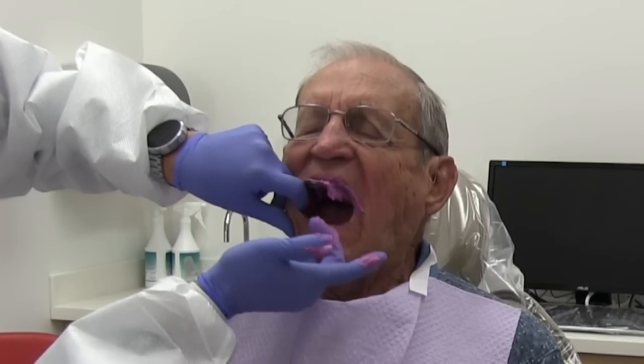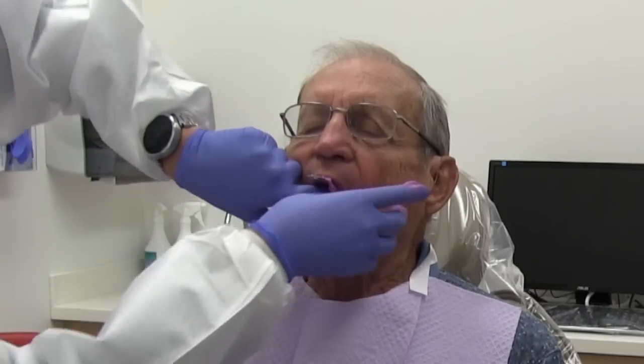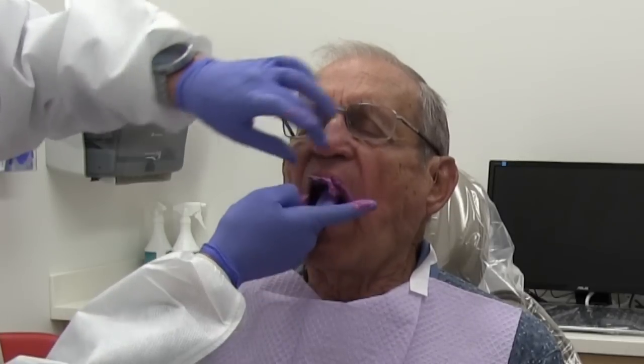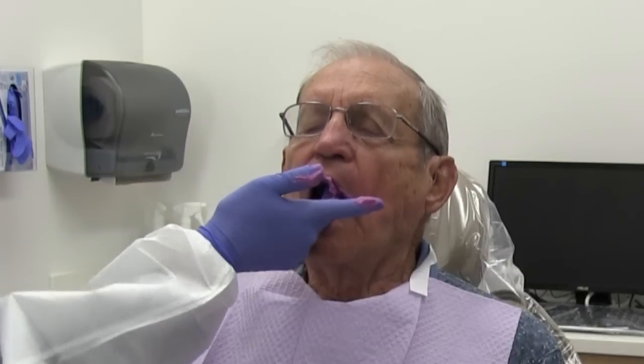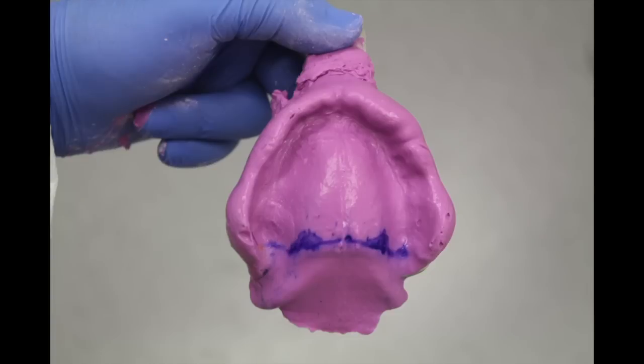This material can be manipulated with different temperatures to accelerate the rate of reaction. I don't recommend the use of minimal amounts of water. I would rather people find a viscous irreversible hydrocolloid like this one here by Zermoc — this is Hydrogum 5. Geltrate is a little bit less viscous.